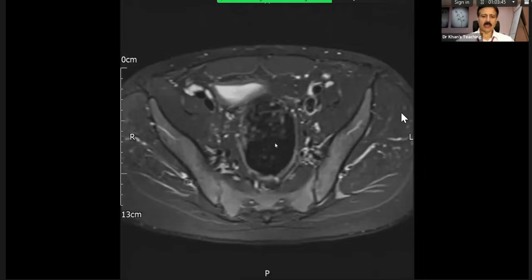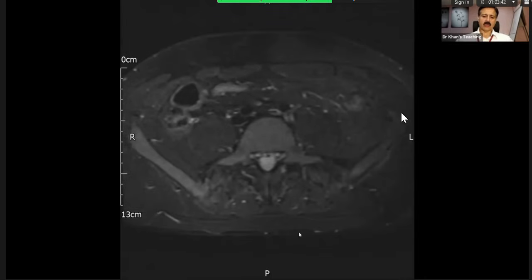Right. Okay. Thank you very much, candidate 1. And now we go to candidate 2. Can you raise your hand, please? Hello. Okay. Thank you. So I am going to stop this share, and I am going to show you some rapid fire further cases before I give you 2 cases like in a viva format.